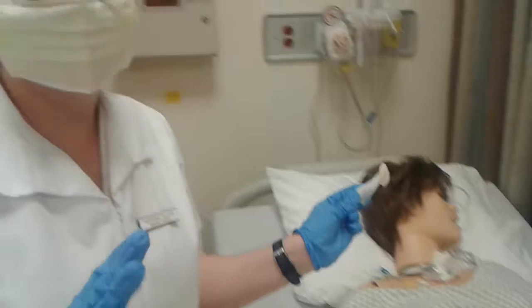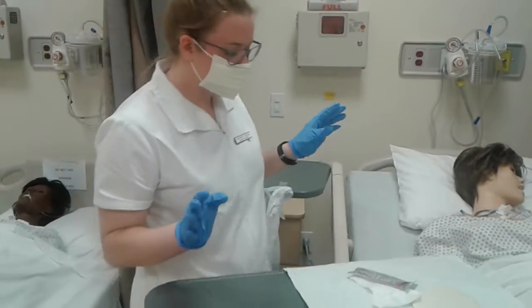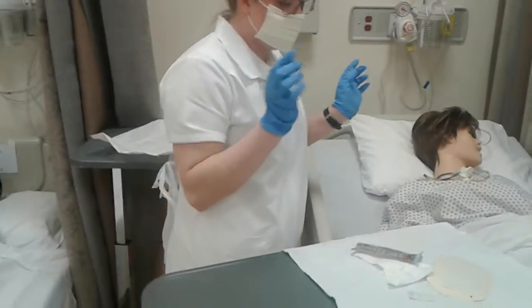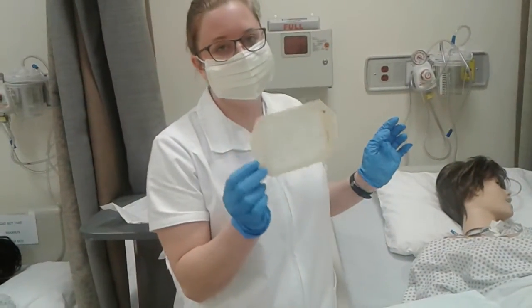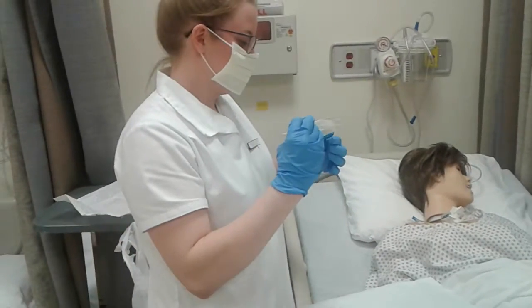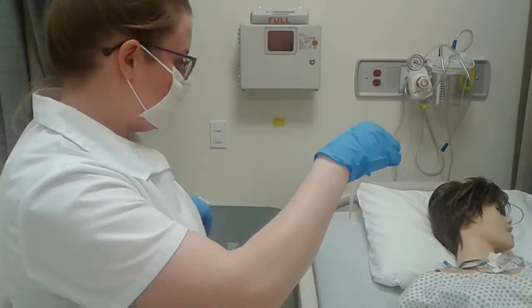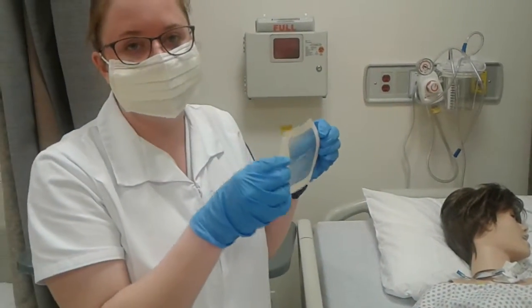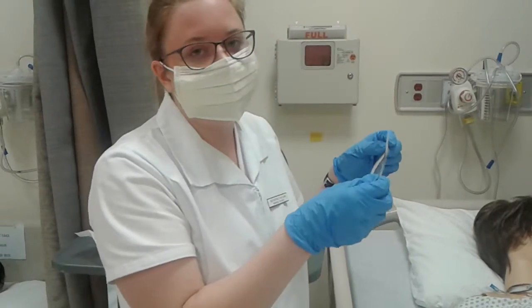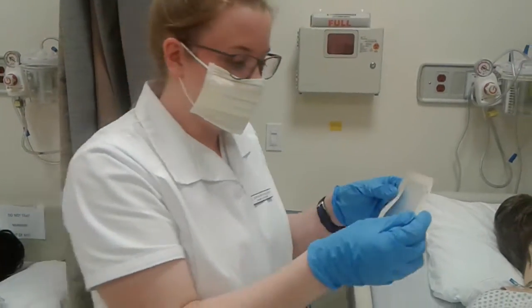So now that the skin is completely clean around the central line dressing, I'm going to throw out my applicator, and I need to place my new central line transparent film over the dressing. I'm going to throw this away. And I want to make sure this is completely occlusive to the central line, making sure there's no wrinkles or holes to prevent any contamination to the site.